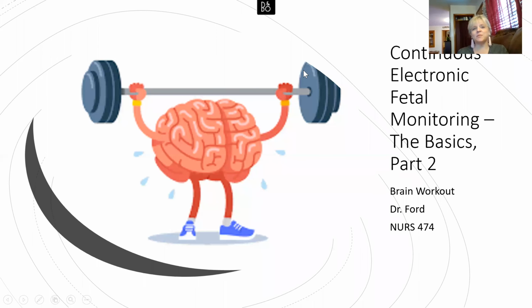Hi everyone, I'm Dr. Ford and I'm leading you through a 6-minute brain workout on continuous electronic fetal monitoring, the basics, and this is part 2.